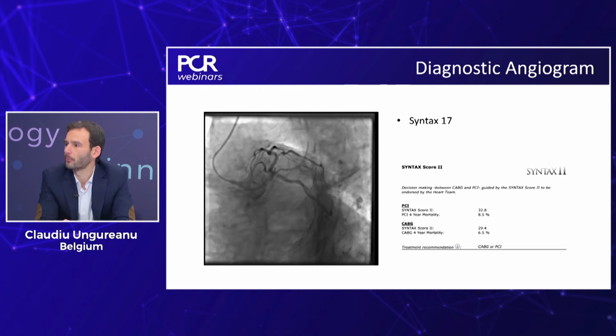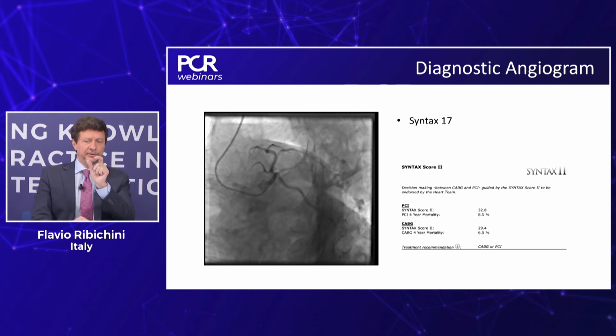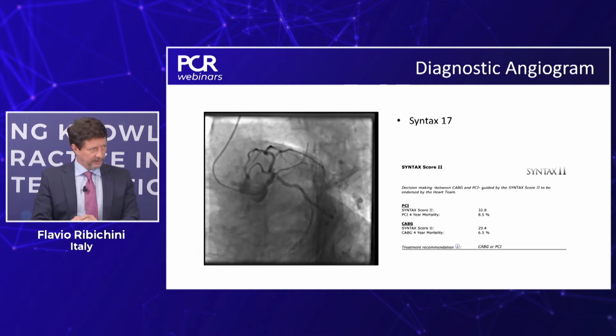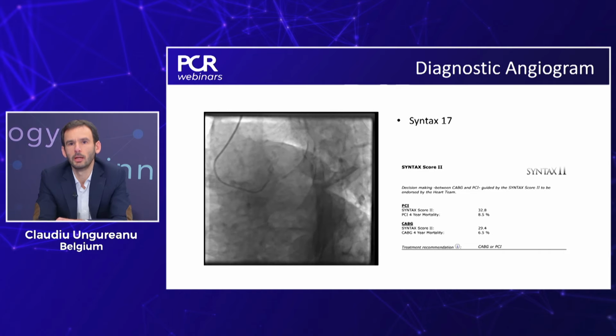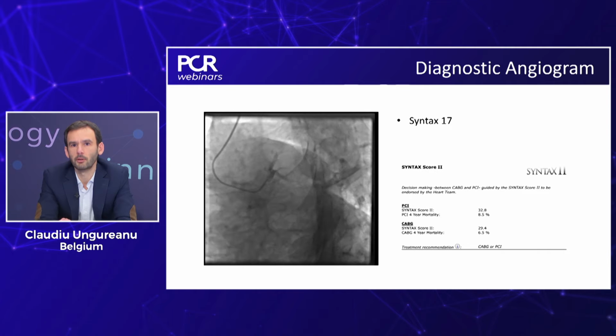And for that purpose, do you use FFR or iFR pullback? Do you use that as an indicator for spotting your stent, or do you consider this a diffuse disease and go, as Claudia did in the case before, from healthy to healthy with a long stent? I think it's reasonable to do this pullback of FFR because you will have much more information. But after that, IVUS gives us important information related to the morphological aspects and distribution of calcium in the arteries, and the size of the artery. We can also evaluate after that whether we have some stent underexpansion and our PCI result. I think in this particular case, we chose the anatomical evaluation by IVUS.